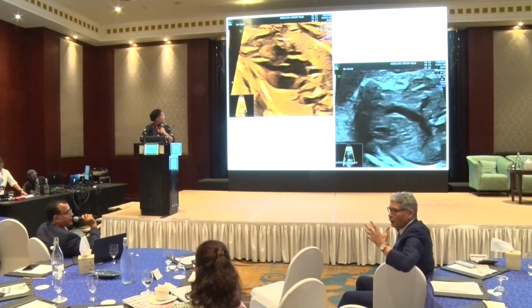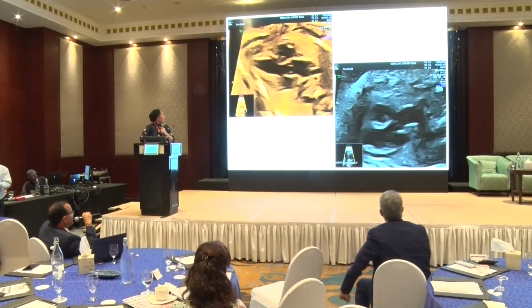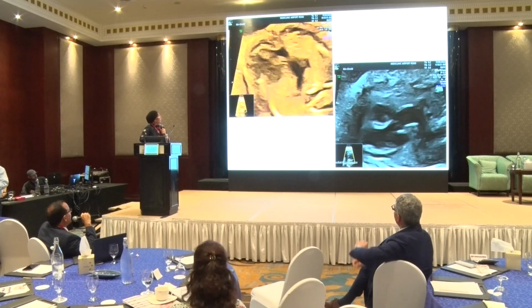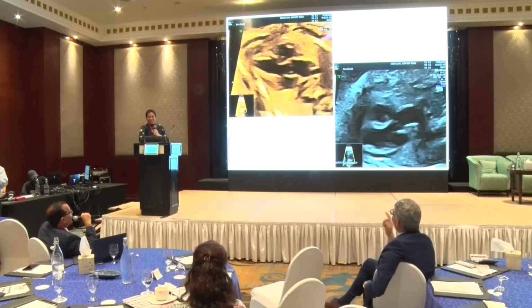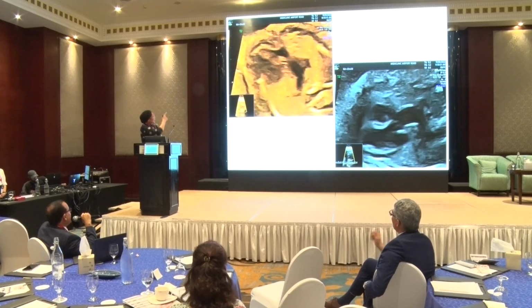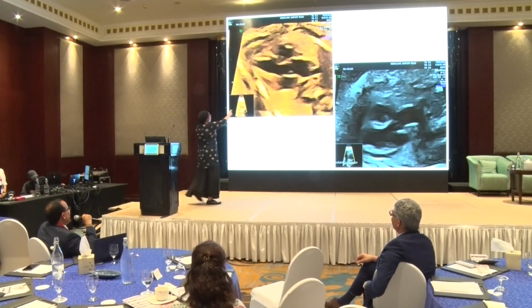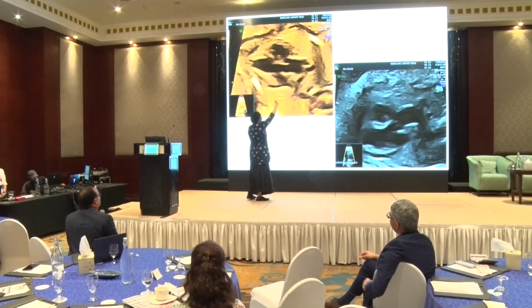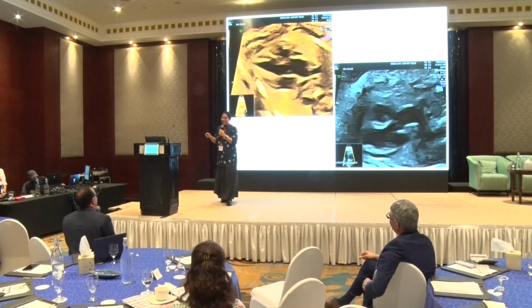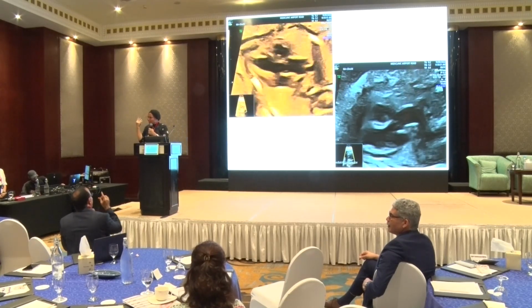Can you hold a second? This is a very beautiful picture. Can you go back to that one? Yes, this one. Beautiful. You see one in a different plane. I agree, Dr. Sulaiman. I will say there is a vessel that is coming from anterior. But you could also argue the main trunk is giving rise to more than 2 branches. Pulmonary, there should be only 2, I believe. So that's another point here.